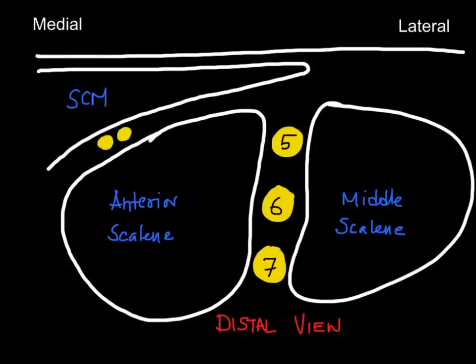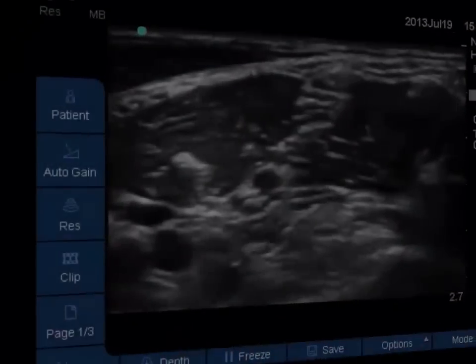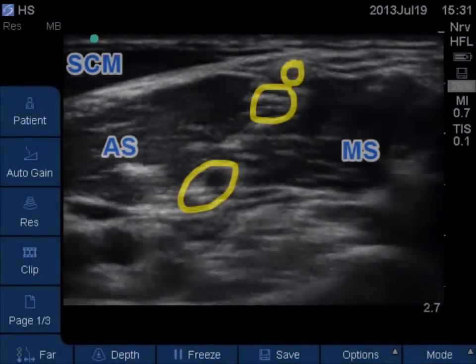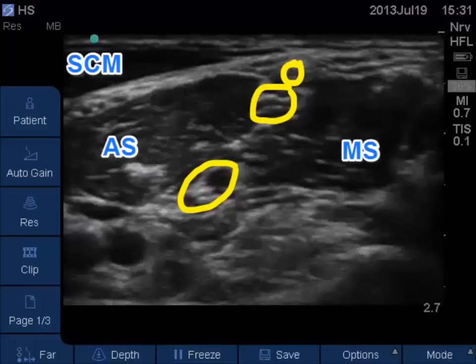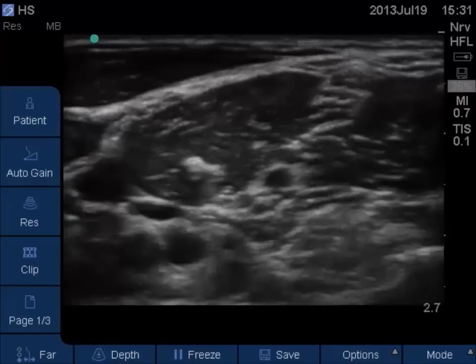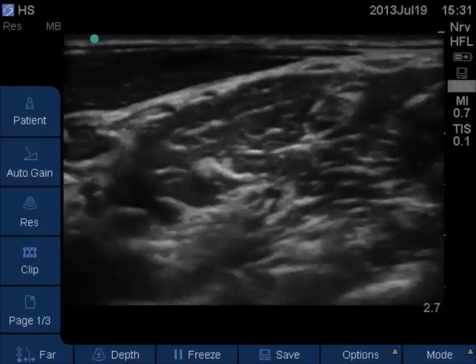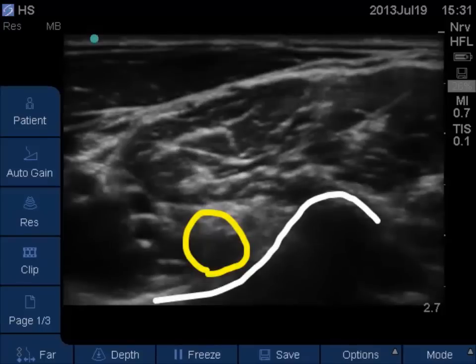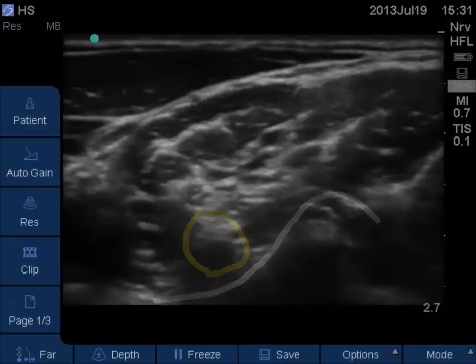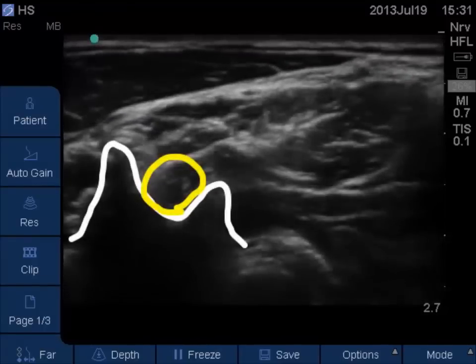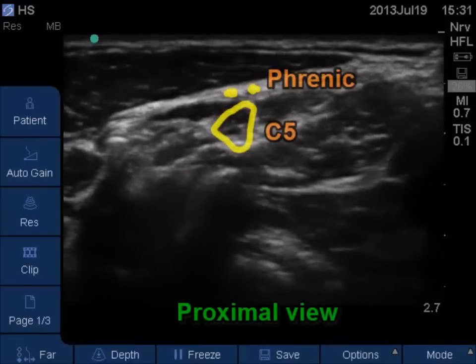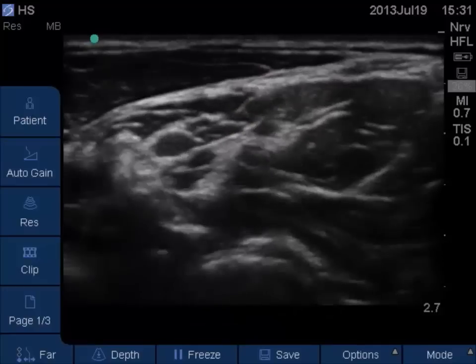Let's also try to understand this by looking at the real-time ultrasound picture. In this representation you can make out the muscles — the sternocleidomastoid, anterior scalene, and middle scalene — as well as the brachial plexus. As we move the probe proximally, we find that the C7 nerve root starts going down into the intervertebral foramen. The next to follow is the C6 nerve root and the carotid tubercle, which is anterior and more prominent posteriorly, while the C5 nerve root is also visible with the phrenic nerve on top of it.